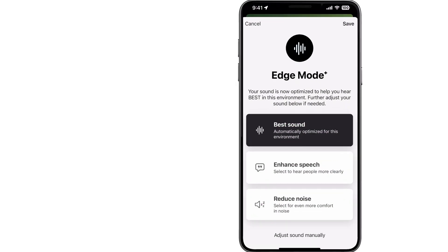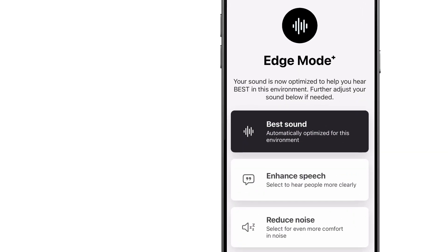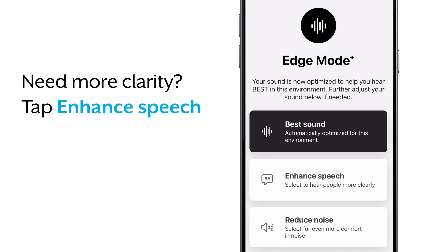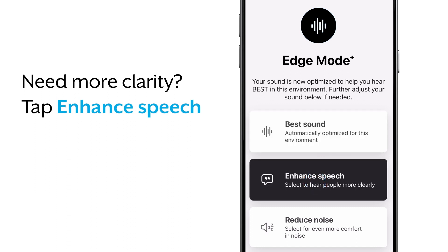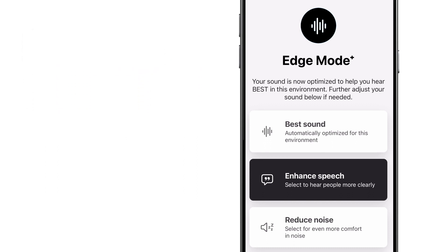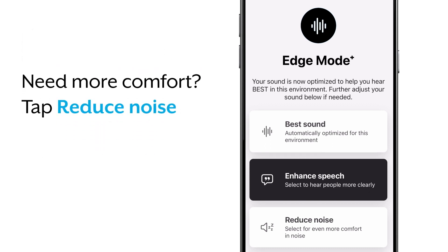In most situations, Edge Mode Plus best sound should take care of your listening needs. But if you ever need a bit more clarity for speech, just tap the Enhance Speech button on the Edge Mode Plus screen. Or, for a little more comfort in background noise, tap the Reduce Noise button.